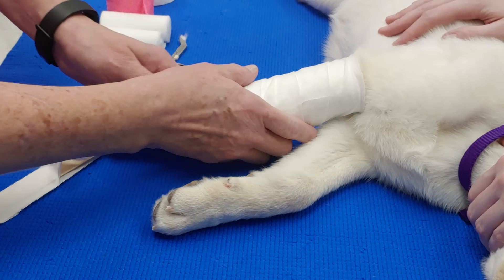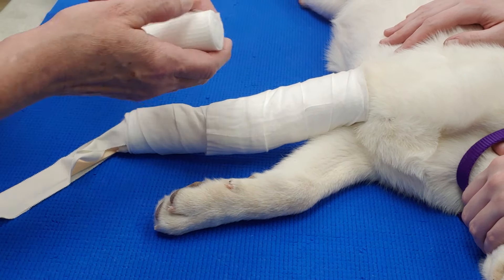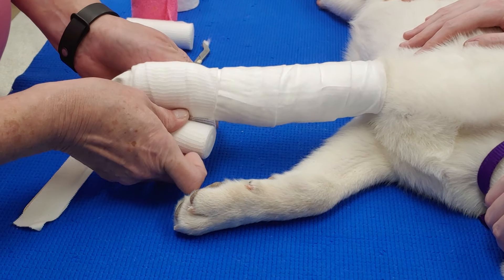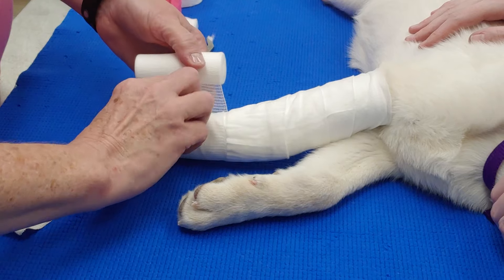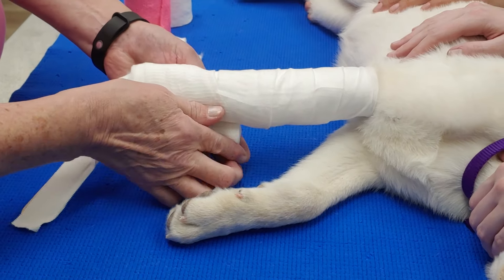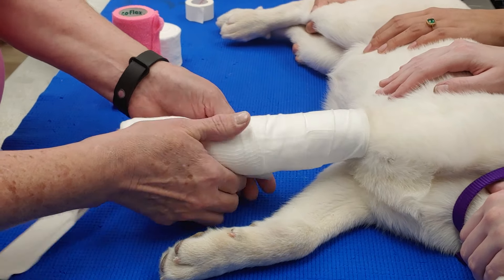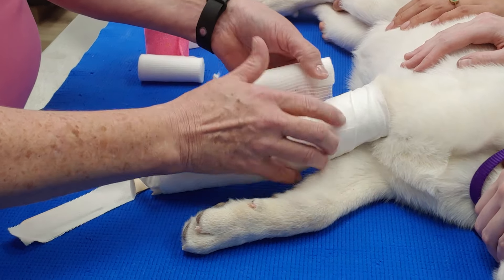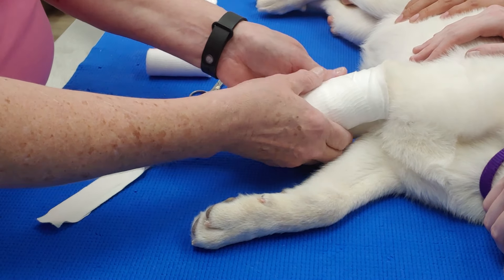Once I get a good layer of that on, I like to put my cling. You can be a little tighter with this — not too tight, but a little tighter because you have that protective layer on. This just holds it in place and adds that extra little bit of support to the bandage.